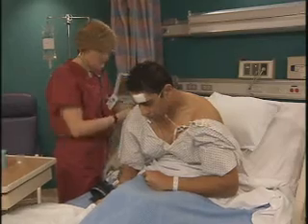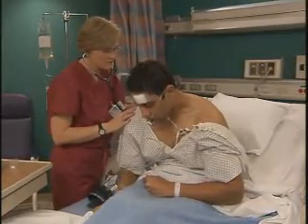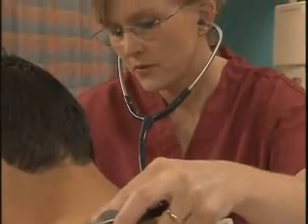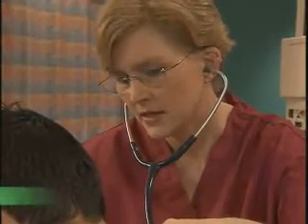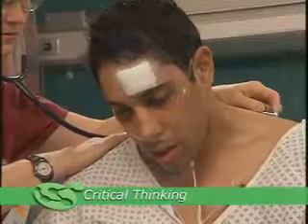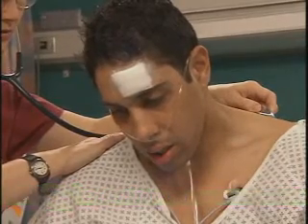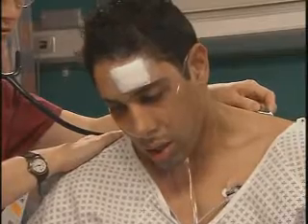Also, auscultate your patient's lungs at least once every hour initially. Expect clear breath sounds to extend to the periphery of the lungs, a sign of reinflation. If the lung sounds remain diminished on the affected side, the chest tube may not be resolving the pneumothorax and may need adjustment, replacement, or increased suction.